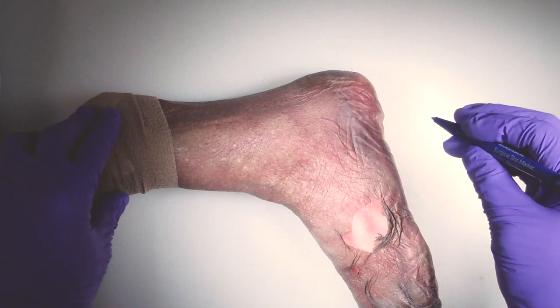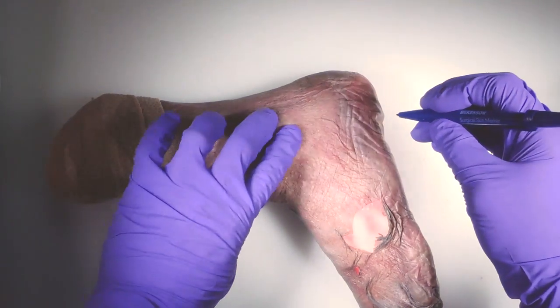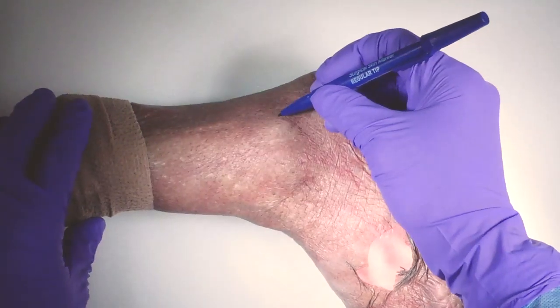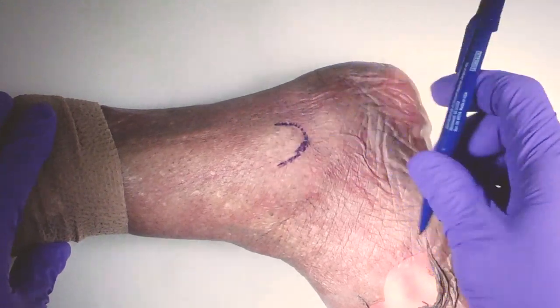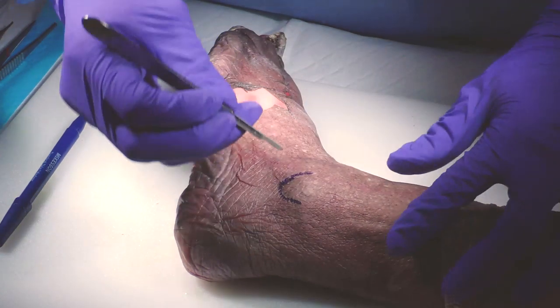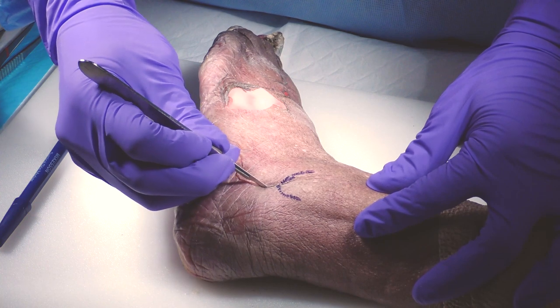Here we're going to demonstrate the technique for the fibular nail. The landmarks are basically the lateral malleolus. I can feel the lateral malleolus right here. I'm going to draw the tip of the lateral malleolus, and you basically make an incision that is about 1.5 centimeters beginning at the tip of the fibula, straight distal.